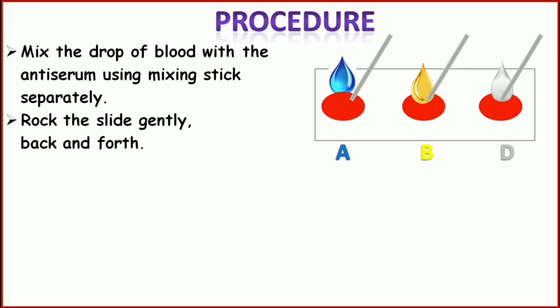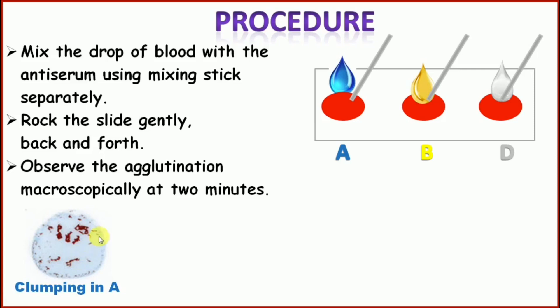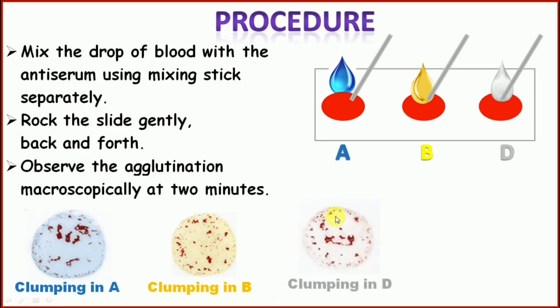After mixing, rock the slide gently with back and forth movement. The final step is to observe agglutination macroscopically at 2 minutes, though the time may vary depending upon the testing kit. If there is agglutination or clumping at marking A, B, or D, it will show a visible clumped pattern. If there is no clumping or agglutination, the drop will appear smooth.